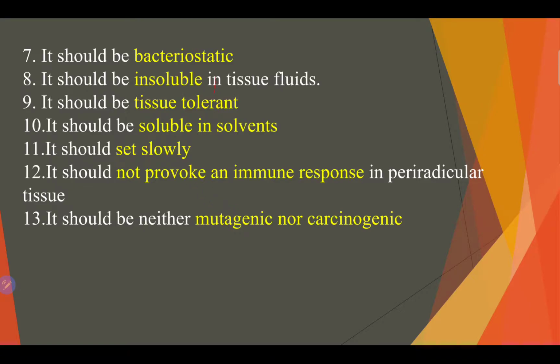Soluble in solvent in case of retreatment. Set slowly or ample working time, so we can work not in a hurry, so ample working time is very good. Don't provoke any immune response in the periapical tissue, and of course not mutagenic or carcinogenic.